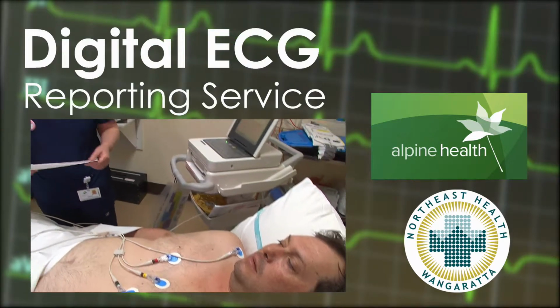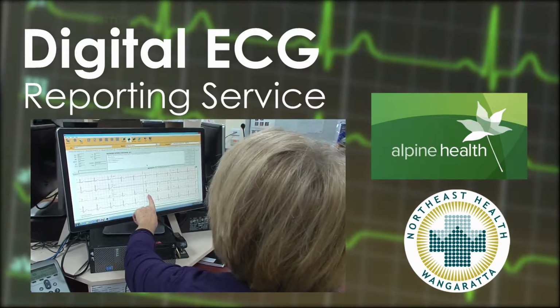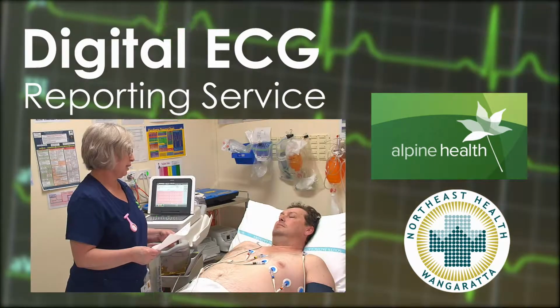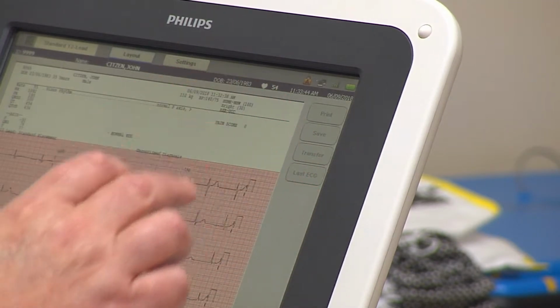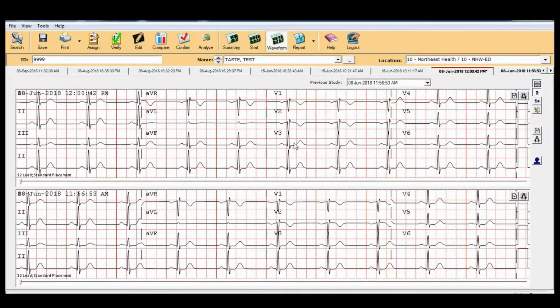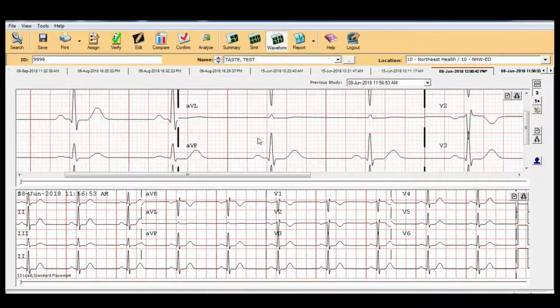The digital ECG reporting service has been developed to support rural clinicians to provide world-class cardiac care to patients presenting to urgent care centres with chest pain and acute coronary syndromes. High-resolution digital ECG images taken at an urgent care centre can be shared through a server and accessed by GPs, regional emergency department doctors and physicians to provide the right level of cardiac care in the right place at the right time.